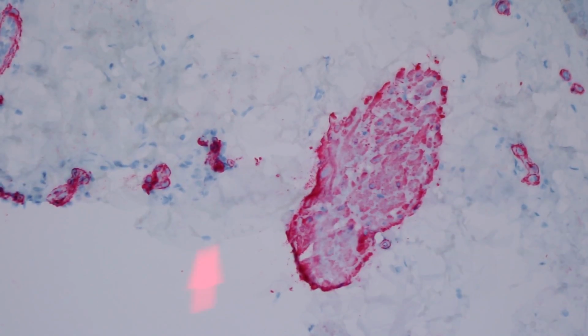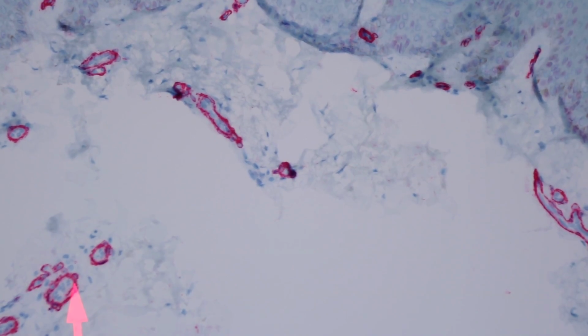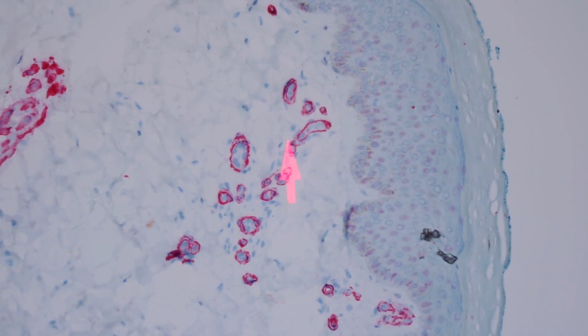beautifully staining, just like they did on the Desmin. But look also in the background. Well, if I can stop moving the slide. Each individual little vessel here is wrapped by a thin layer of actin. So these are pericytes around these small vessels. Pericytes are modified smooth muscle cells that wrap around small vessels.